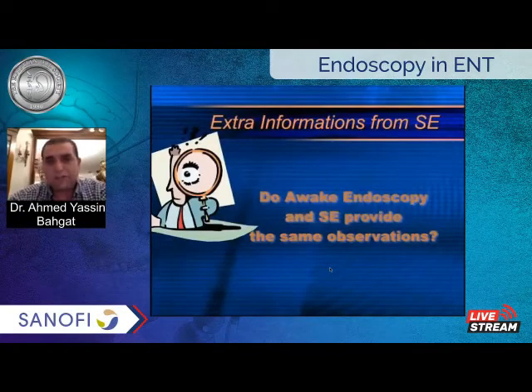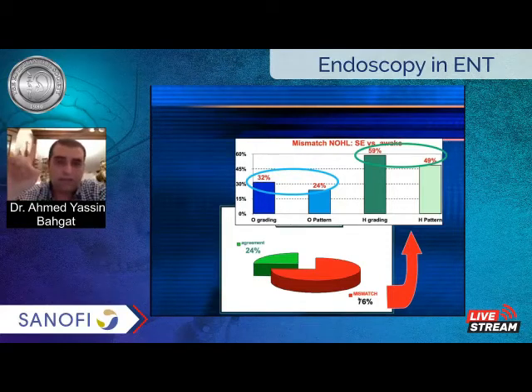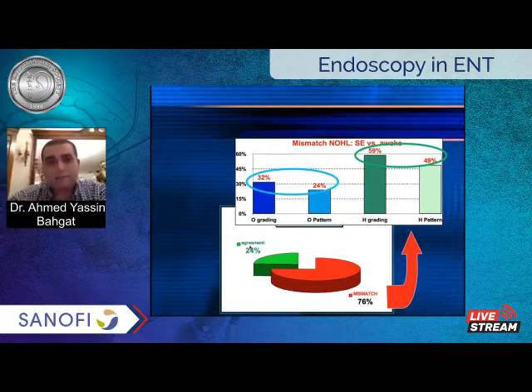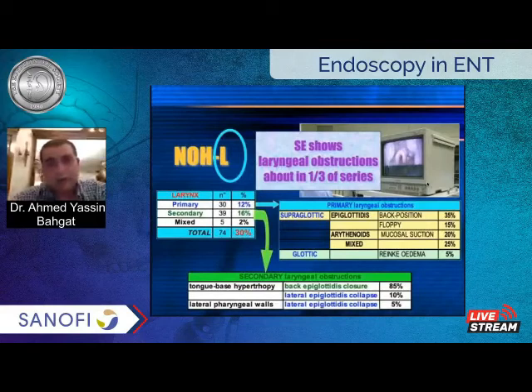I think it really matters, because in this study, Professor Claudio Vicini studied more than 250 cases, and he found that there is 76% mismatch between awake and sleep endoscopy. So in four patients, in one patient you will hit the problem, and in three patients you will miss them, either in the pattern or in the grade of airway obstruction in the oropharynx and in the hypopharynx. Moreover, the laryngeal obstruction, you can never see while the patient is awake.